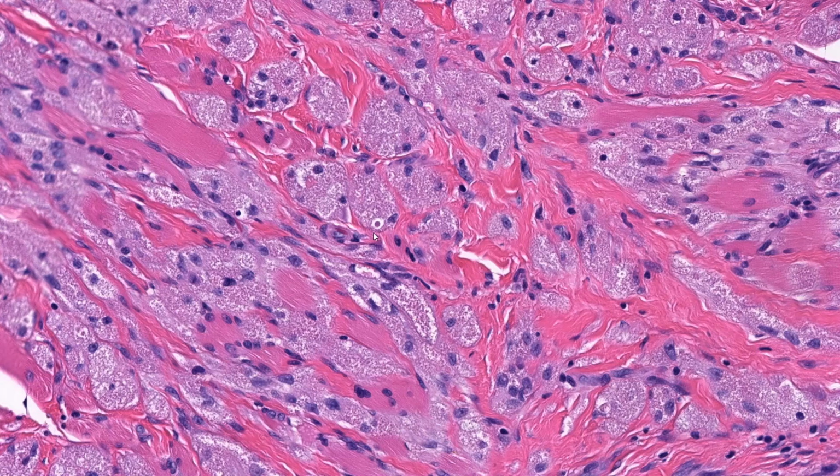The nuclei are round to oval with some size variability, but nuclear features are uniform, with vesicular or bubbly chromatin and a central punctate but not prominent nucleolus. Lastly, I don't see any mitotic figures or necrosis.